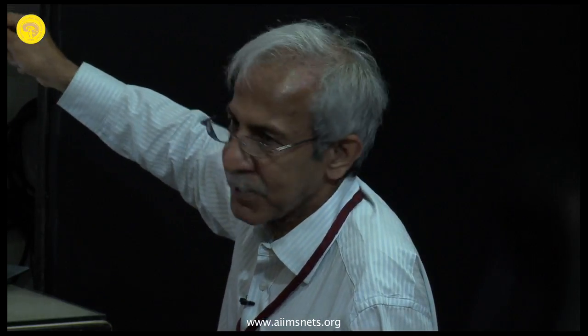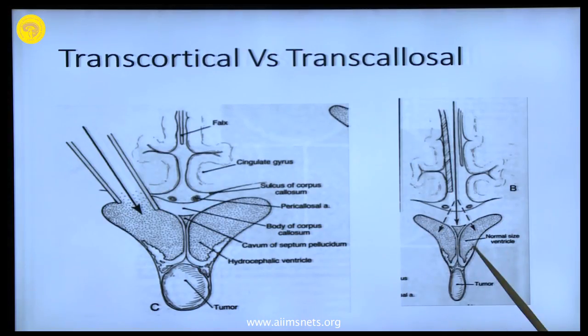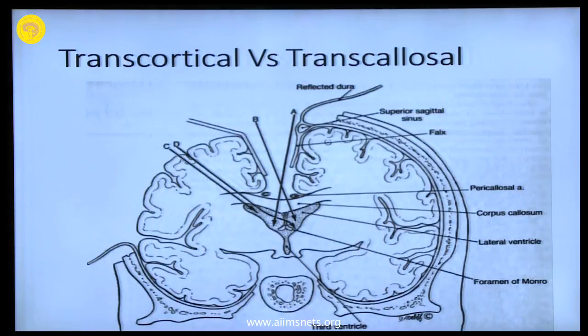If you are happy to see that, then you can enter both sides. Remaining in the midline is an art, and once you go into the midline, you will feel much happier and have a better anatomical view of what you are doing. Sometimes you see both ventricles, and then you can retrospectively identify the midline.